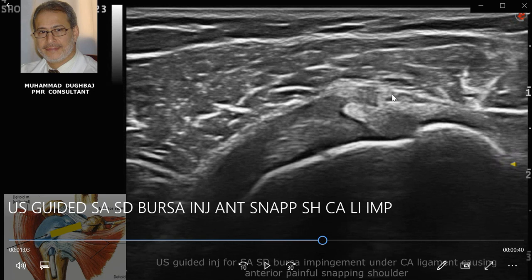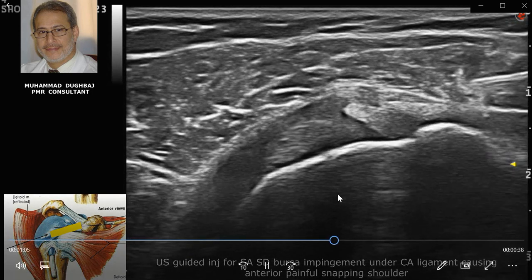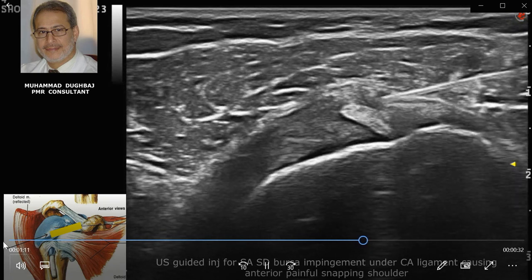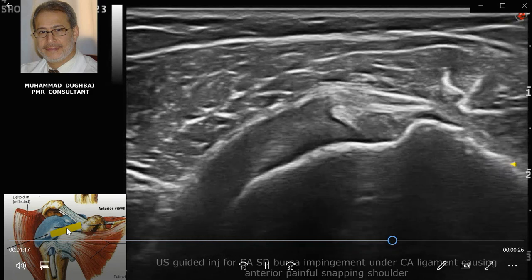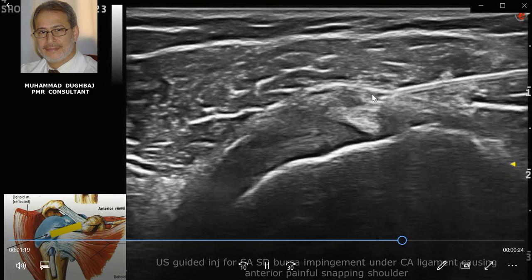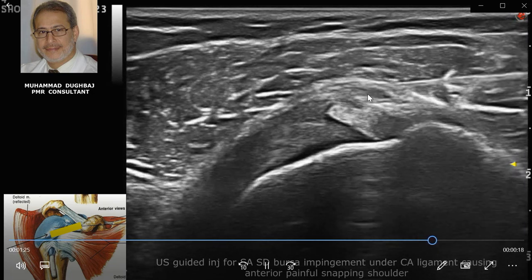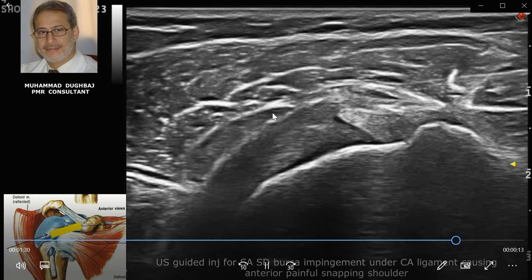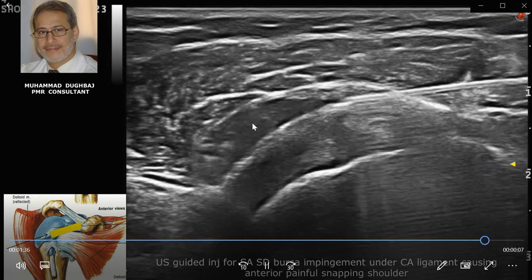I will now start the procedure. You can see the needle approach coming — I will dissect at the site of impingement to place my injectant under ultrasound guidance. The needle comes from a lateral approach directed slightly upward towards the medial side. The jet of the injectant is then used to hydrodissect the subacromial subdeltoid bursa. Here is the rotator cuff interval, and then we seek the site of impingement.